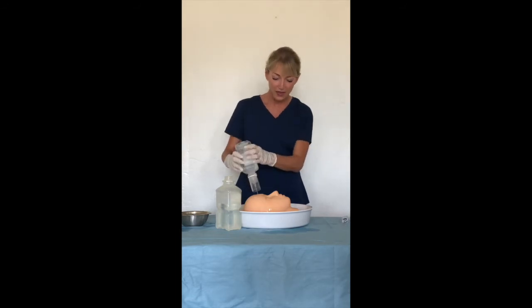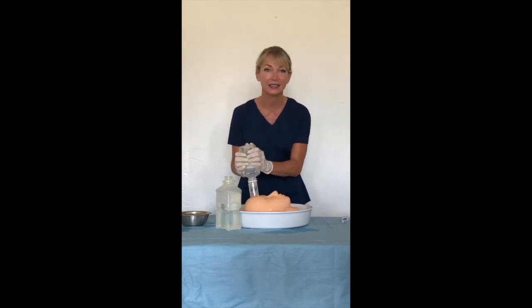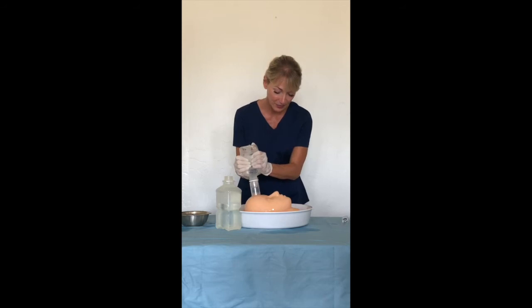So this is a 500 milliliter saline bottle, and within about the next 10 seconds, you are going to see me deliver approximately 200 milliliters of fluid to the simulated wound.